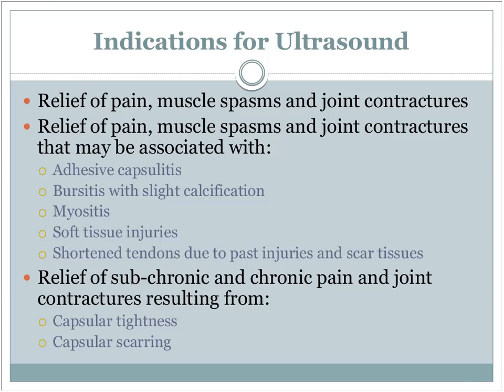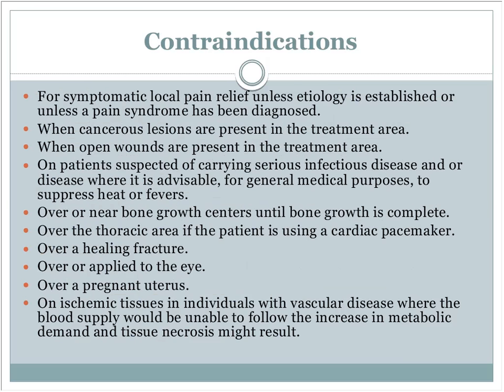If you'll notice, I will not talk about phonophoresis, and this borders on personal opinion, but there is research to back up the statement that doing phonophoresis is no more effective than rubbing cortisone cream on the skin. There's no difference in the depth of penetration, and it has no more lasting effect or any other effect than just putting cortisone cream on the skin. So that's what I'm going to say about phonophoresis.